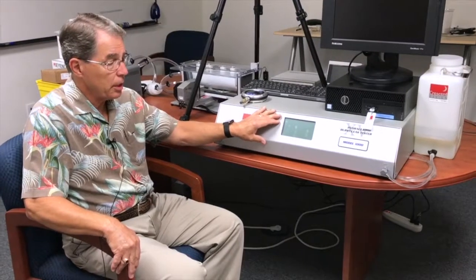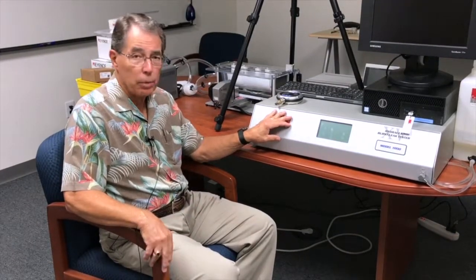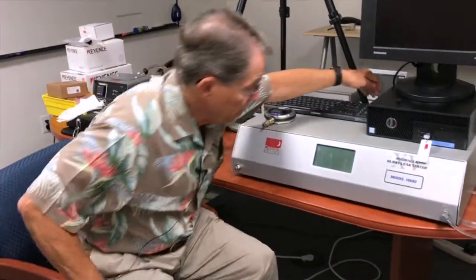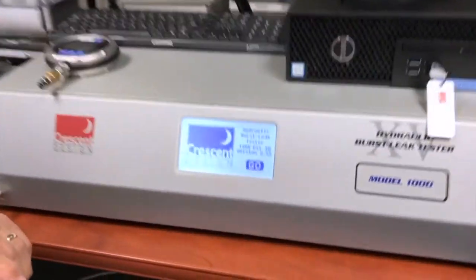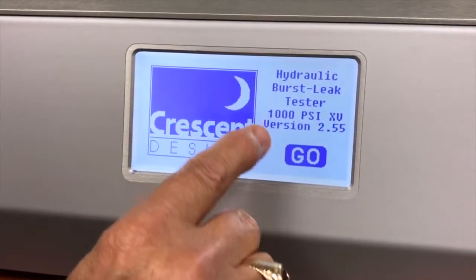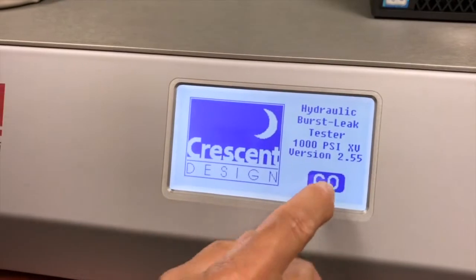Your HBLT — I have it turned off right now so that you can see how to find the software version — but prior to calibration you would want to have your HBLT in the environment that it's going to be used, turned on for about 24 hours so that all the temperatures inside equilibrate and it is ready for calibration. I'm going to go ahead and turn it on. You'll notice on the screen it gives the pressure and the model number — in this case it is version 2.55 — and we'll go ahead and hit go.